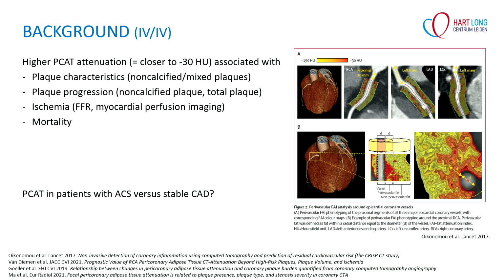So we started with that. We started with the routine stuff, where I see something on the CT, and I know, because we published it for the first time, so many years ago, on non-calcified plaque in 2007 in JACC, we were doing a care track, because we didn't have a fast track chest pain unit. So what we did when the patient came in during the day and they didn't have an infarction, they just had an ECG that you didn't feel comfortable with, they had complaints, and we did a CT scan with them. And if the CT scan was positive, we took them straight to the cath lab, only during day hours because we could not do that at night.